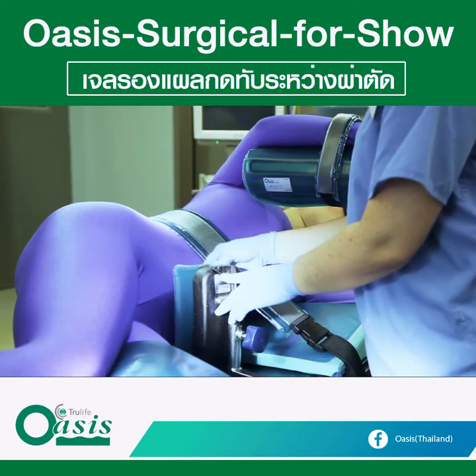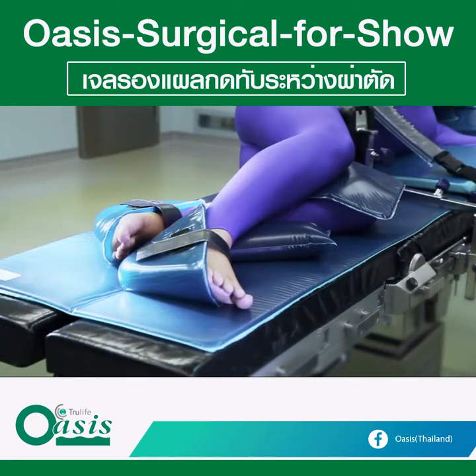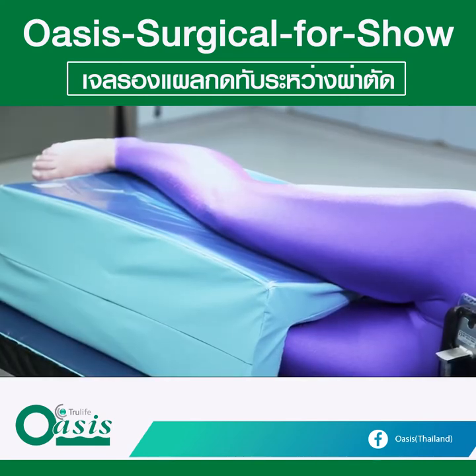Some of the gel pads can be adhered to positioning devices. A small gel pad can be used between the bony prominences of the knees and ankle booties for the lateral malleoli. A leg positioner can assist with good surgical alignment for hip surgery. It also allows for the lower limb to be flexed, which is very important for patient comfort and safety.